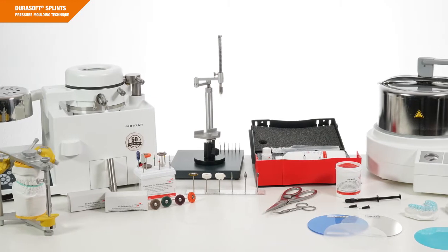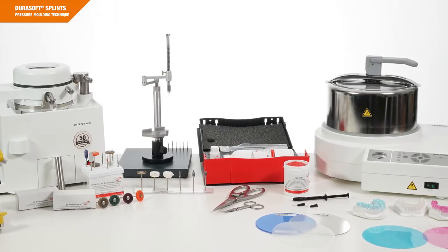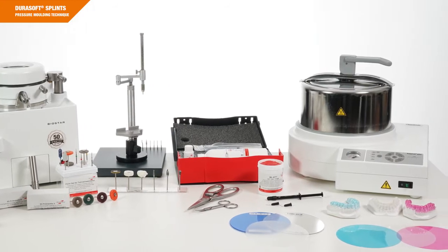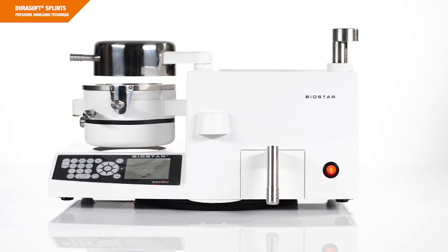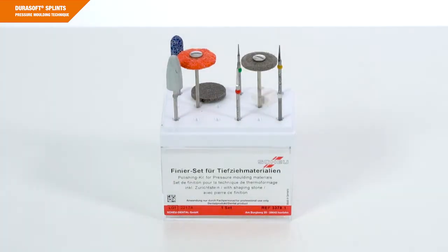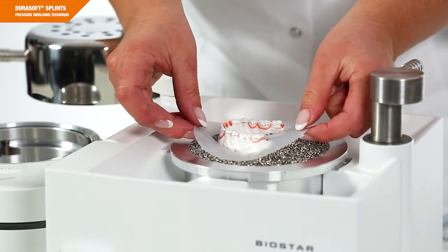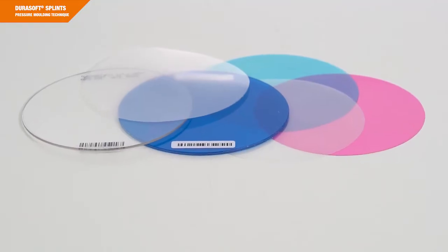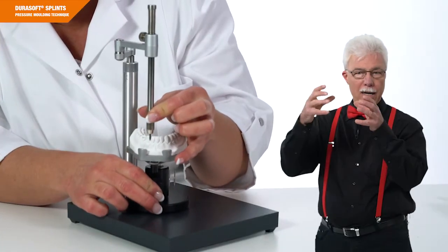Before we begin, I would like to briefly refer to the technical equipment and materials required for fabrication: our pressure molding devices Biostar or Mini-Star S, the finishing set, a pellet cover, materials of the DuraSoft product family, and a parallelometer.